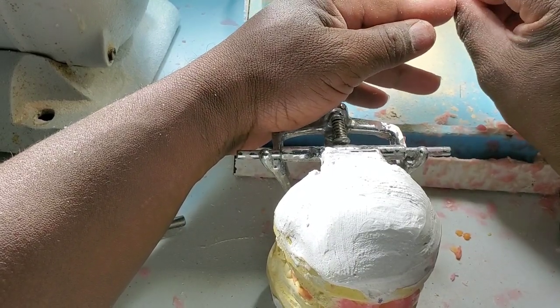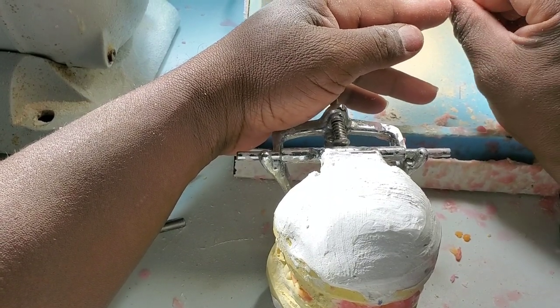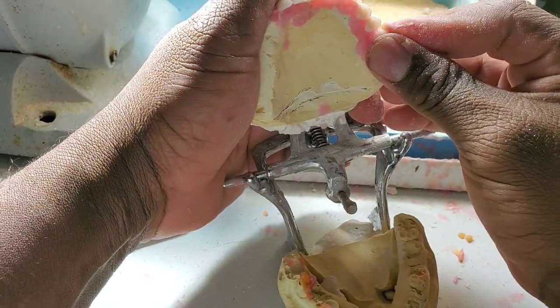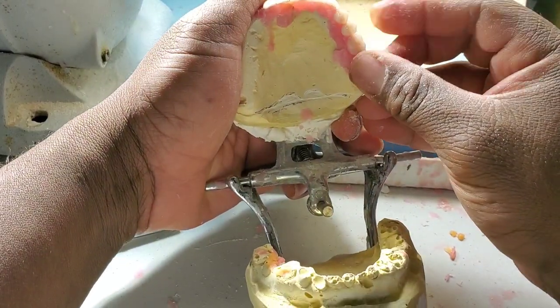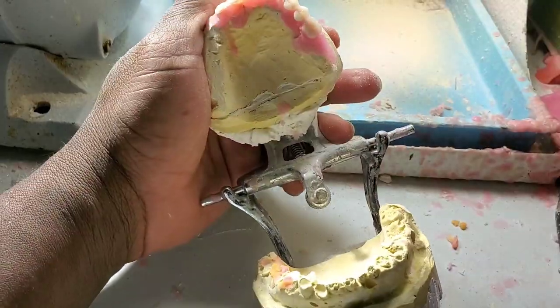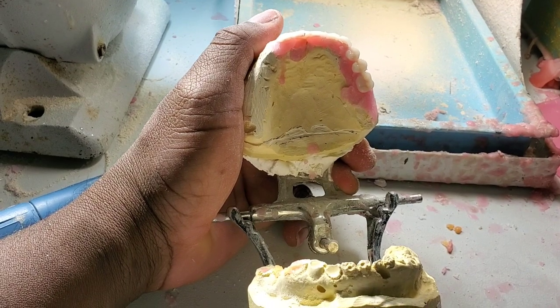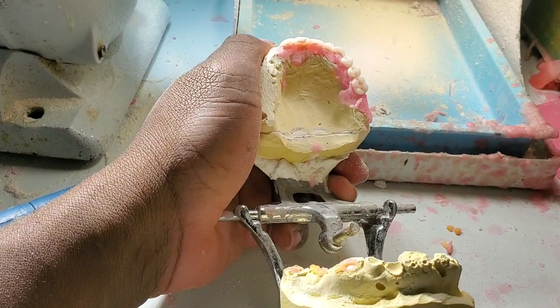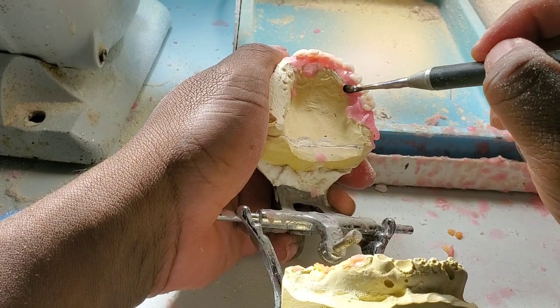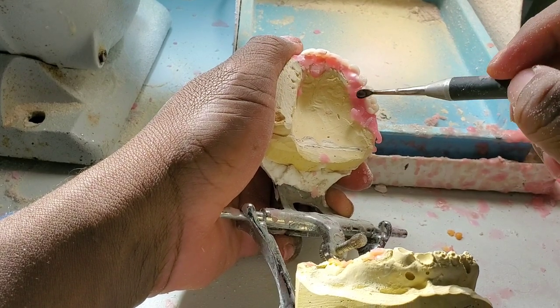Average time to do this is about an hour and a half, or faster depending on experience. It should not take you more than an hour and a half to two hours. But you can work on it for a week. For those of you at home trying to learn how to do this — if you're planning to have surgery, most places will offer you a package of extraction plus immediate denture, and possibly a permanent denture after.